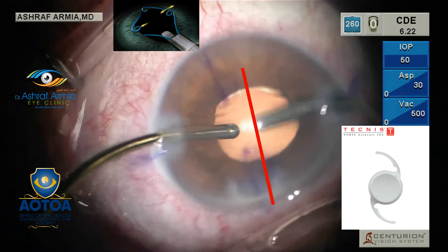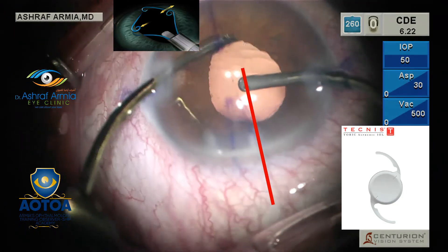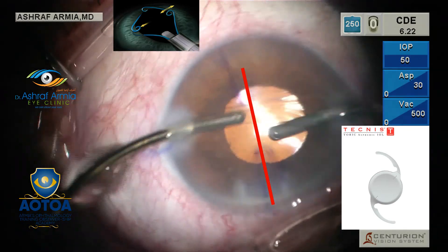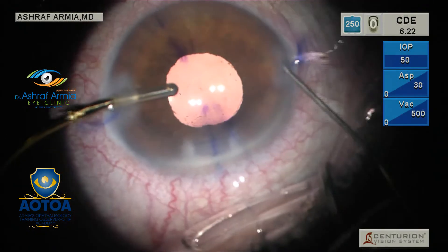You can see the four dots of this unique lens very clearly, even as the pupil is becoming narrow — as is the case from the start, since this is an IFAS case with senile miosis. You make sure that you place the lens in the proper alignment, as you have marked your axis.